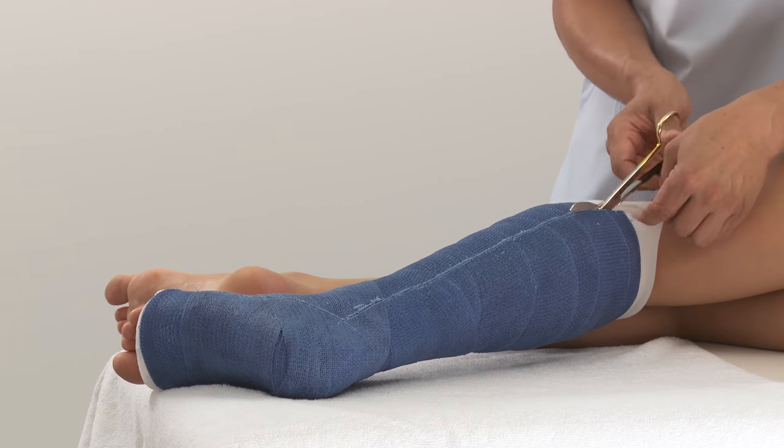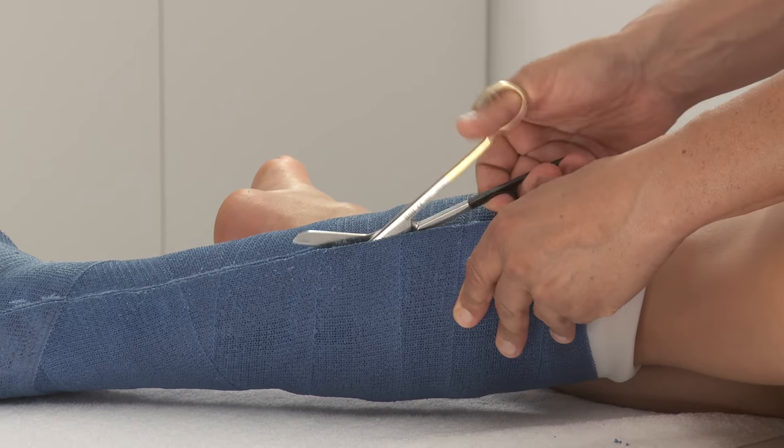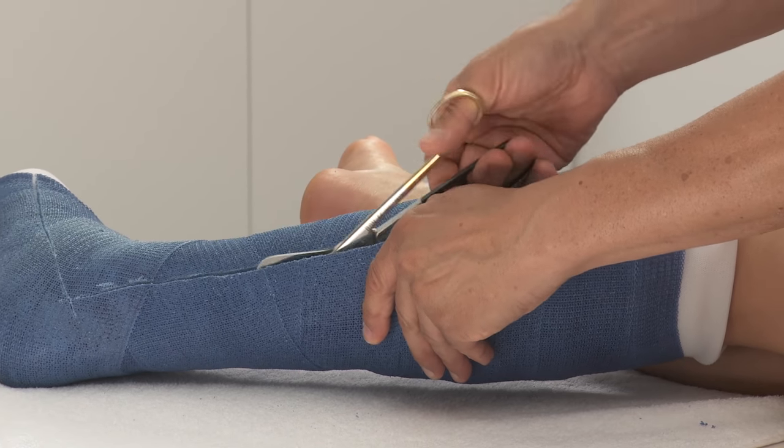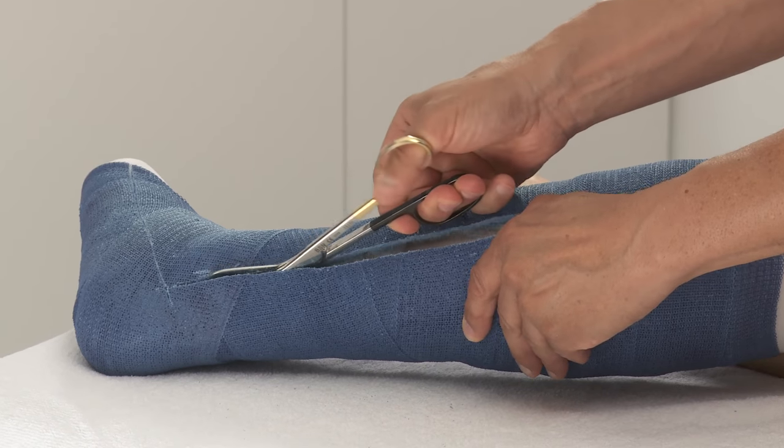With the scissors, cut along the outside saw line — first from the top of the lower leg moving down, then from the distal end of the foot towards the ankle.